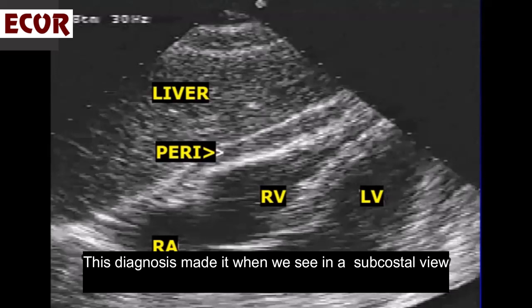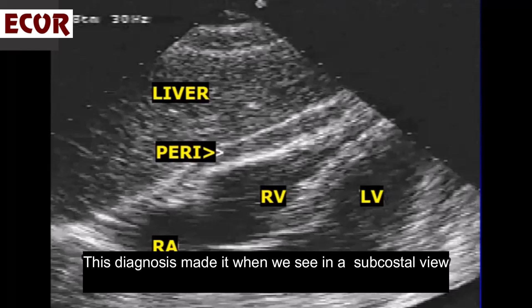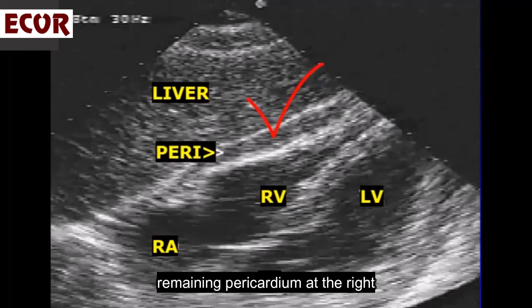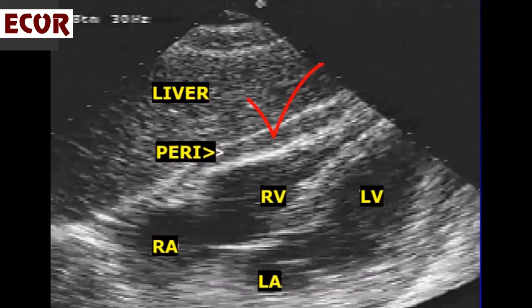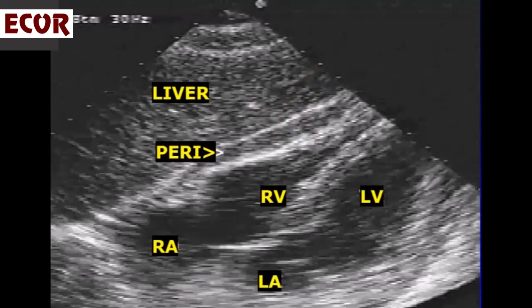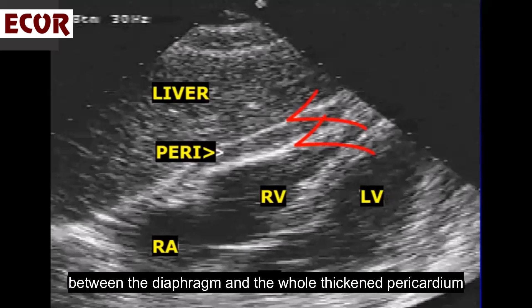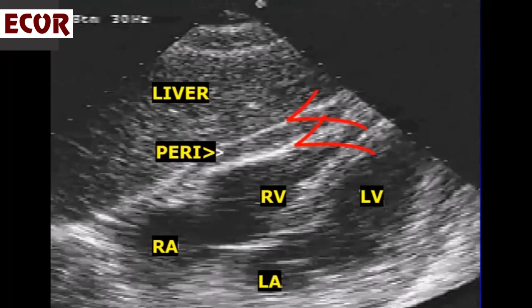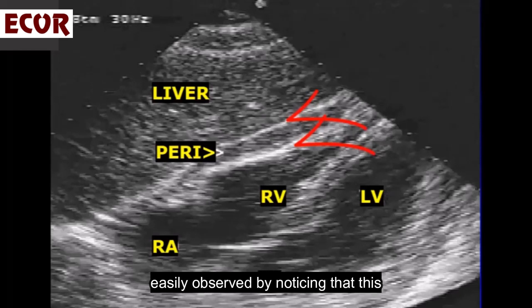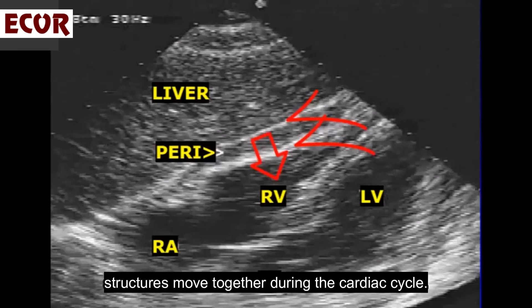This diagnosis is made when we see in a subcostal view the diaphragm and pericardium and notice how thick is the remaining pericardium at the right ventricular wall, usually well demonstrated. The main sign is that there is a fusion between the diaphragm, the whole thickened pericardium, and the right ventricular wall, easily observed by noticing that these structures move together during the cardiac cycle.